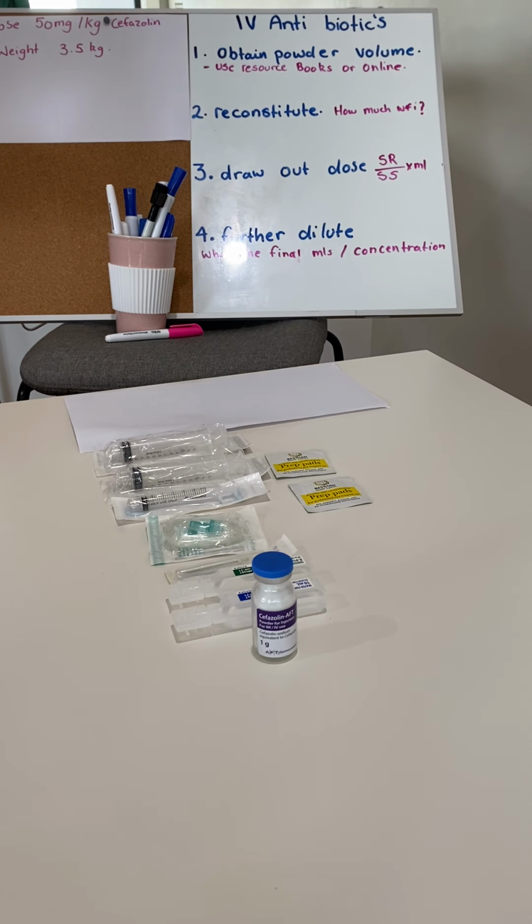Now we're going to go over the reconstitution of IV antibiotics. I have a helper here who's going to help me draw up while I do the calculations. So the first thing that we need to know is what we're actually giving and how much of it we're giving. Today we've been written up cefazolin of 50 milligrams per kilo. We know our baby weighs 3.5 kilos, so we need to work out our dose.